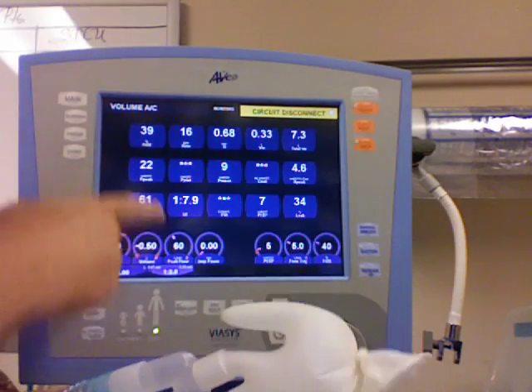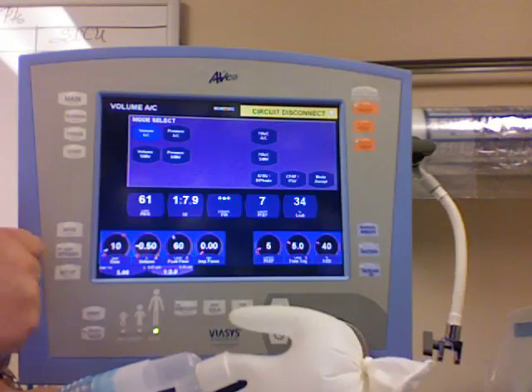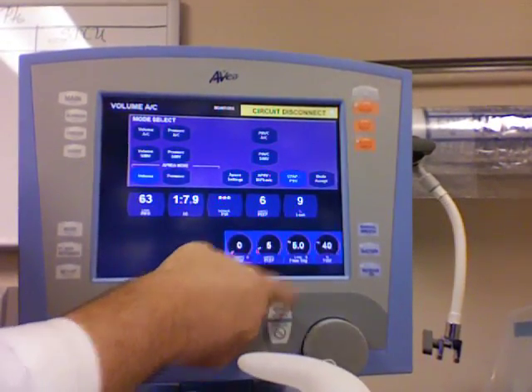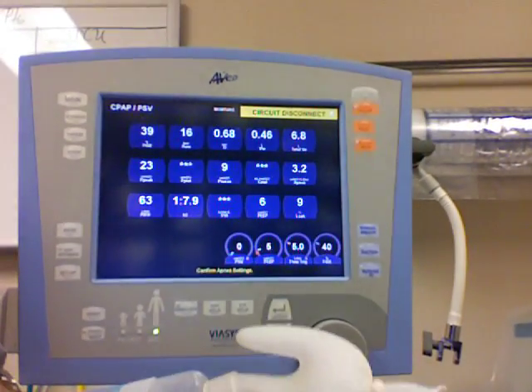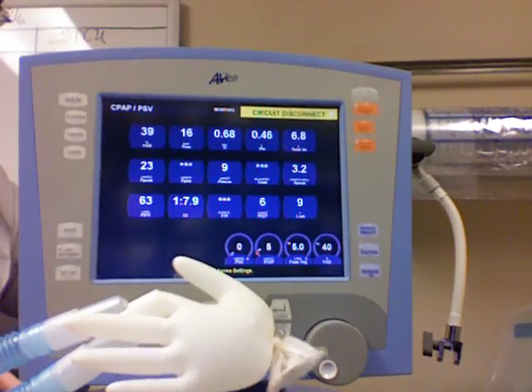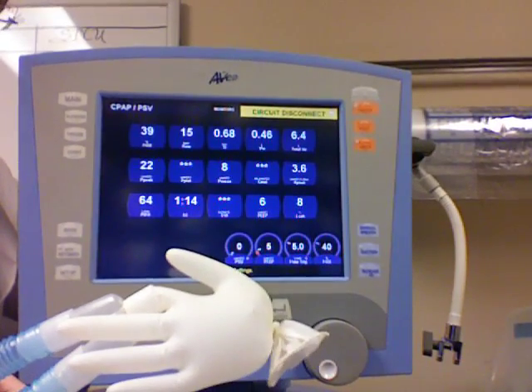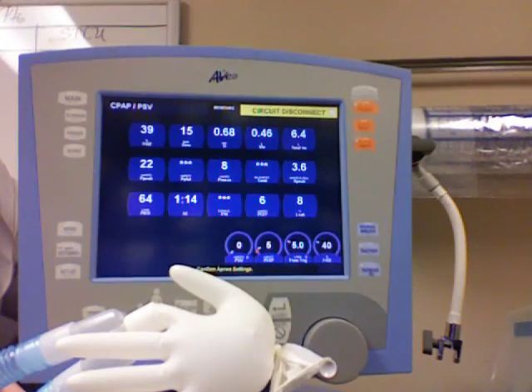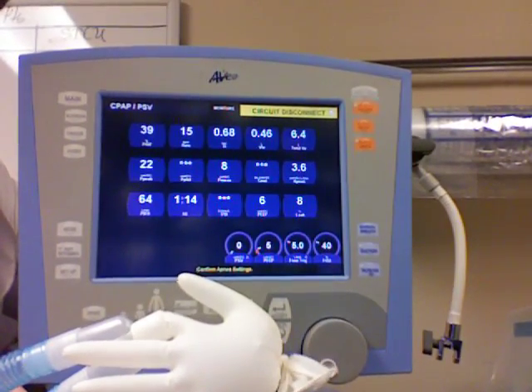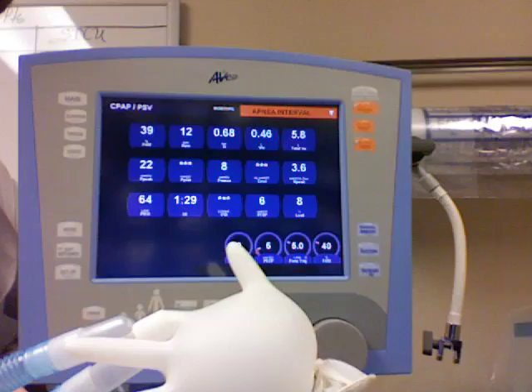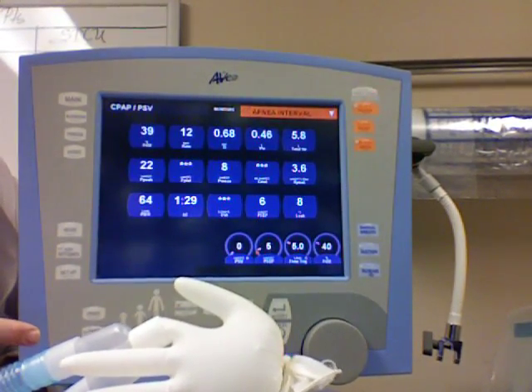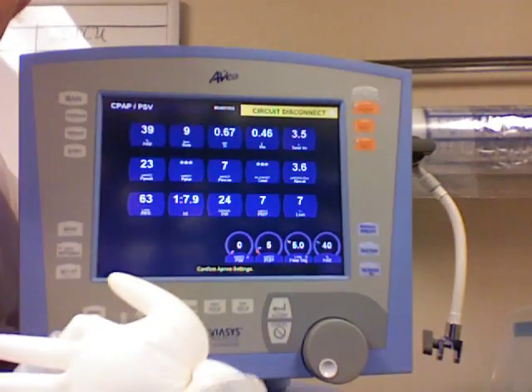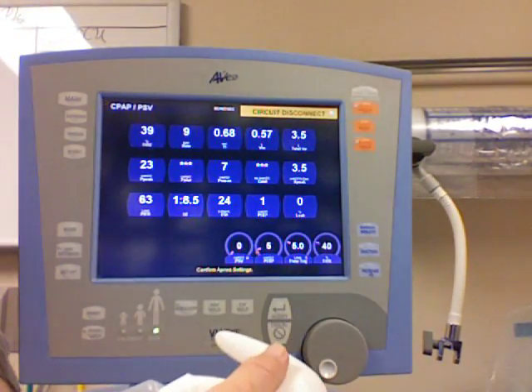I'm going to change this machine over to mode CPAP and accept. Now I'm in CPAP, and if you'll notice, the machine waits five or six seconds and it doesn't give a breath — well there's a reason for that. CPAP is spontaneous breathing. The ventilator got tired of waiting, took over, and started doing apnea ventilation. Okay, I'm on CPAP and I'm breathing spontaneously.